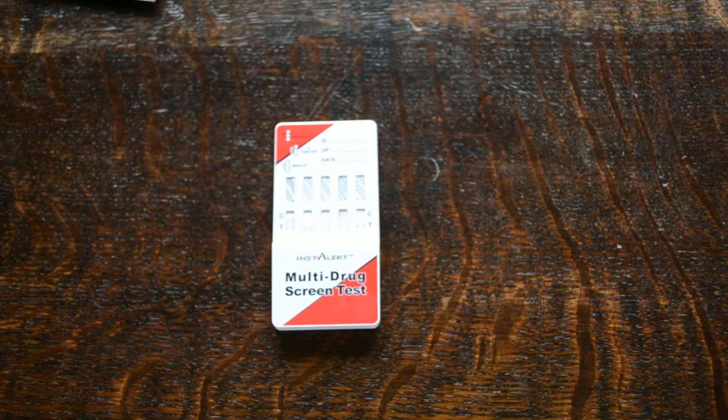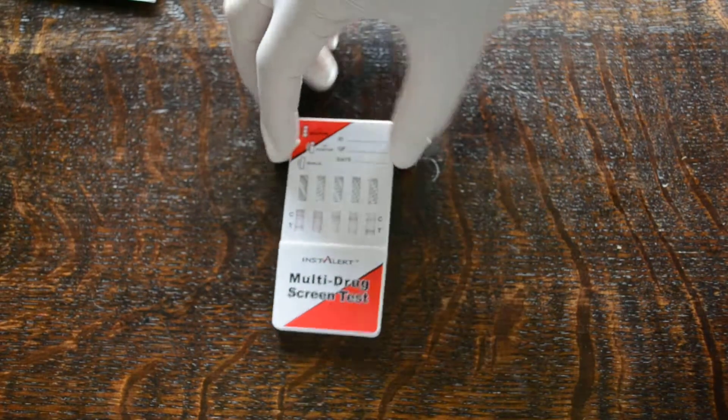They're all going to take between two and a maximum of eight minutes to run and develop. You're looking for the standard format: the presence of a control line, then interpreting the presence or absence of the drug by the presence or absence of a test line. If there's drug present at or above the cutoff level, no test line will form — just a control line — giving a positive result. If there is no drug present, the dye will bind to the test line and it will form, giving a negative result.